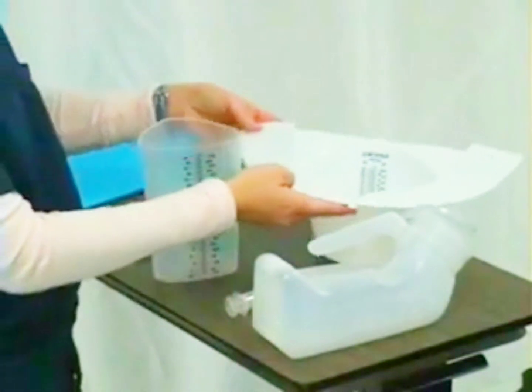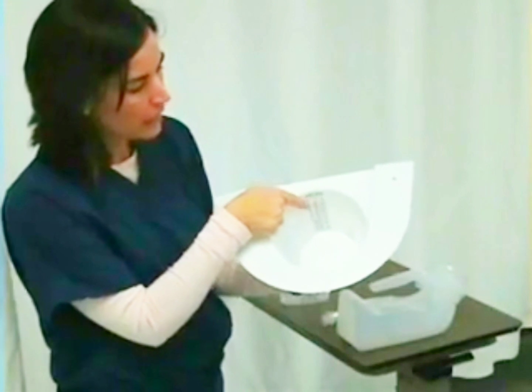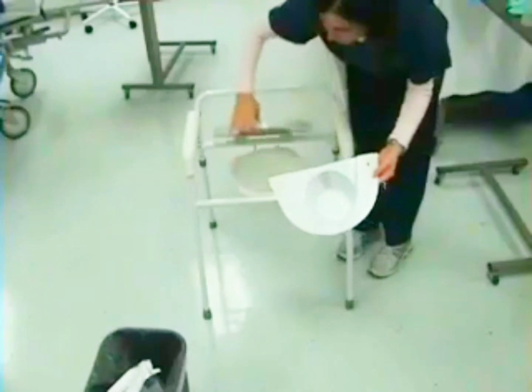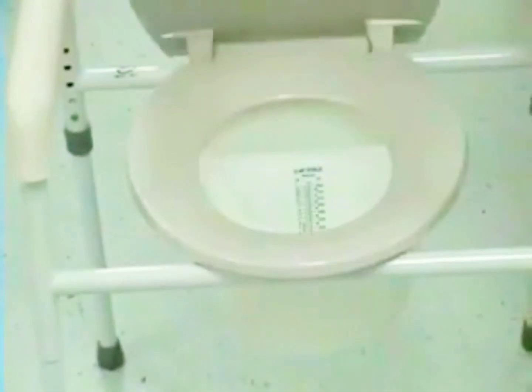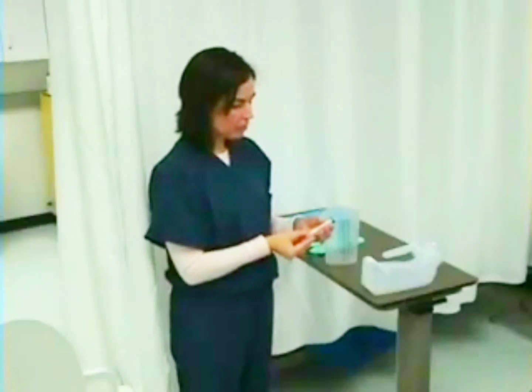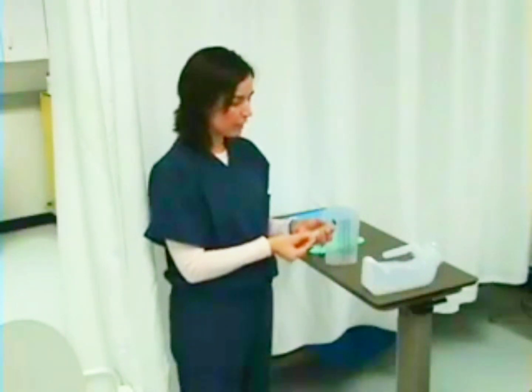For female patients, this is a hat. It has measurements on the inside and goes inside the toilet or the bedside commode. It is placed in the toilet or the commode like that. I also have a 10 ml syringe to deflate the balloon on my Foley catheter before removing it.